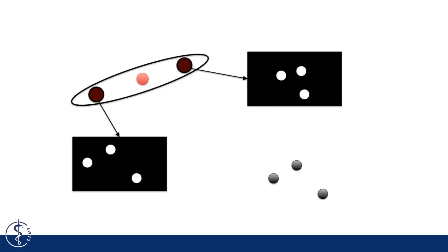In order to know the probe's location in space, a tracking system is needed. It comprises a pair of cameras, an infrared illumination source, and retroreflective markers. When the illumination source flashes, the markers can be easily detected in the images of the two cameras. From the different pixel positions of the markers in both images, their 3D location in space can be inferred.